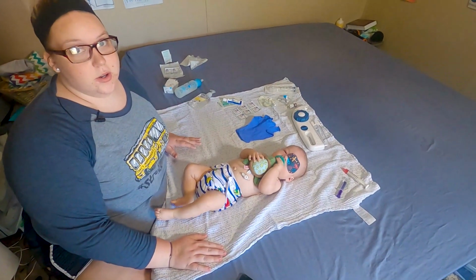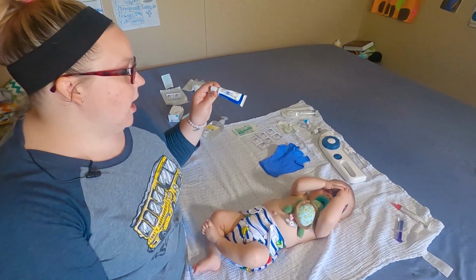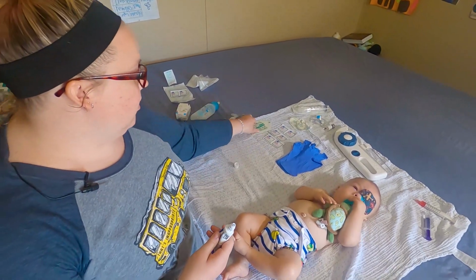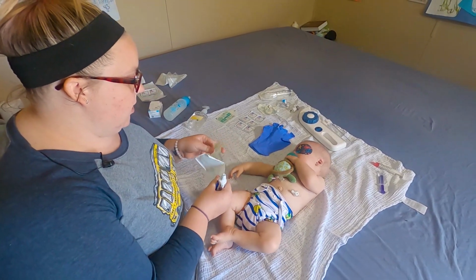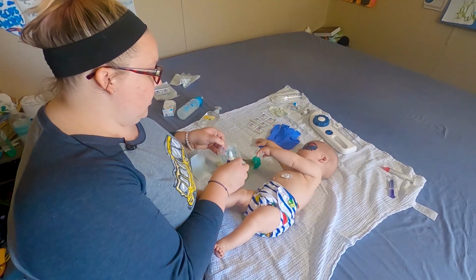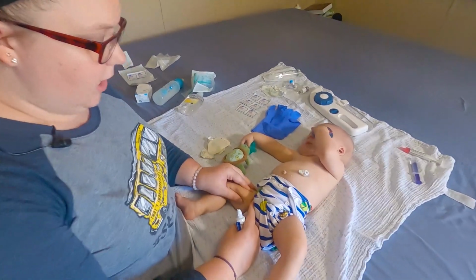All right. So the first thing that we do, this is all of his setup for his stuff. And this is his lidocaine cream and prilocaine cream. So I usually just prep our Tegaderm. I love this stuff. It is amazing. So I usually just open these up. Of course, he's more mobile now, so he makes everything harder. And I just take one of his legs and make sure his diaper is completely out of the way.